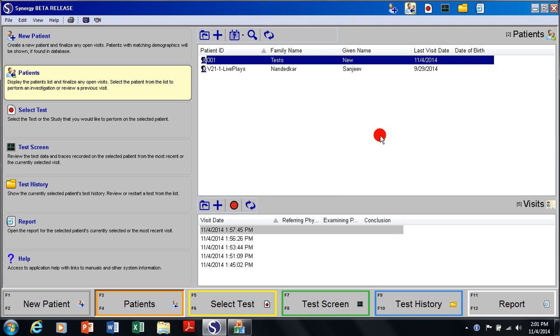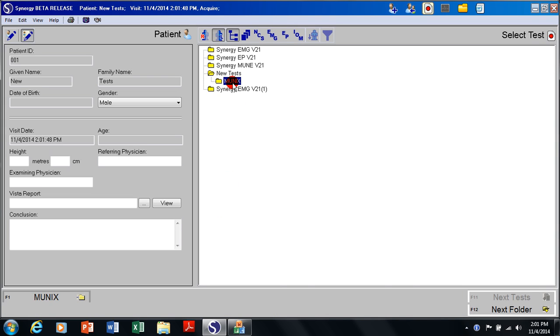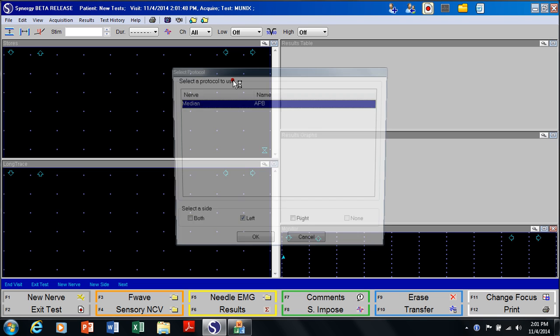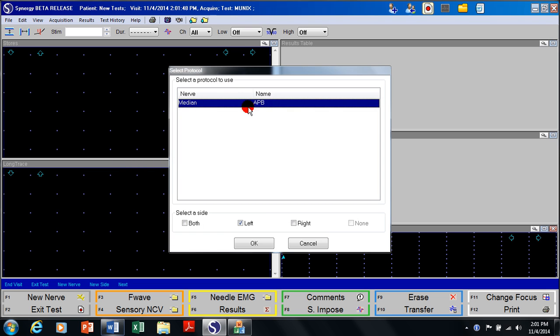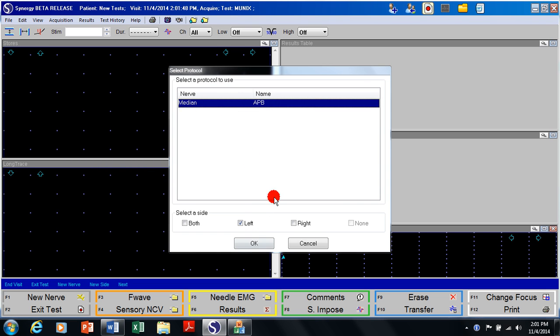This video will illustrate MUNIX recording. I have selected a patient, I'm going to start a new visit, start the MUNIX program and choose the muscle.